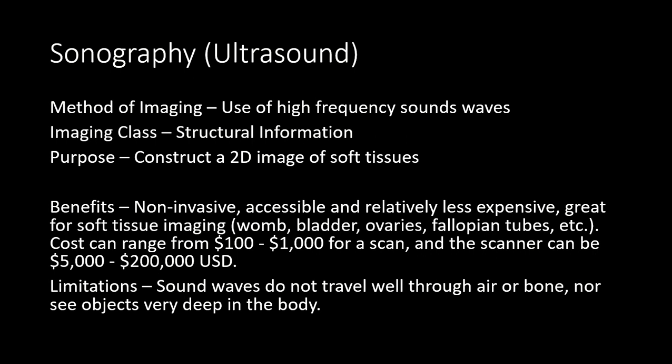Sonography, or ultrasound, is a method of imaging that uses high-frequency sound waves. This is just to give structural information about what's inside the body, and the purpose is to construct a 2D image of the soft tissues in the body, sometimes including a developing fetus, a developing child. The benefits are that this procedure is non-invasive.